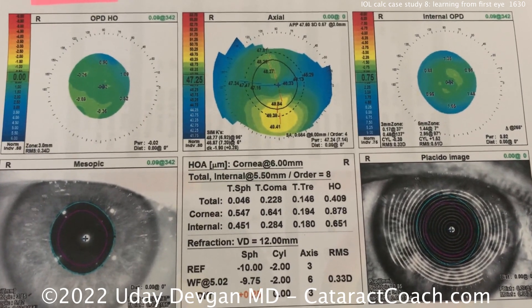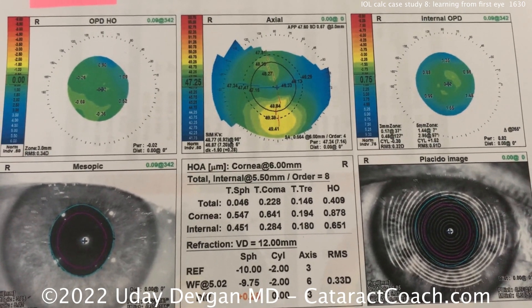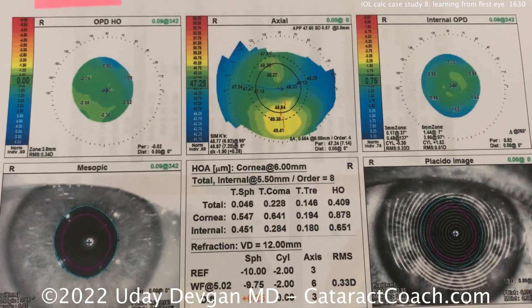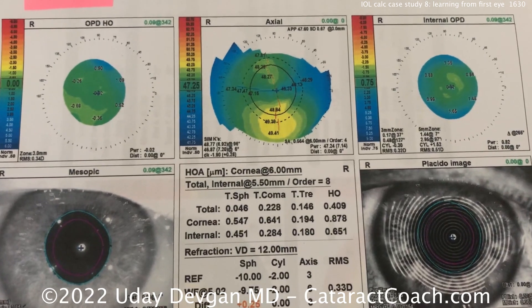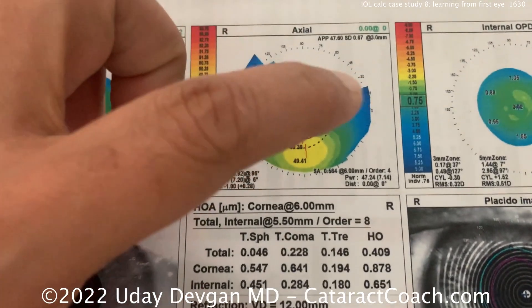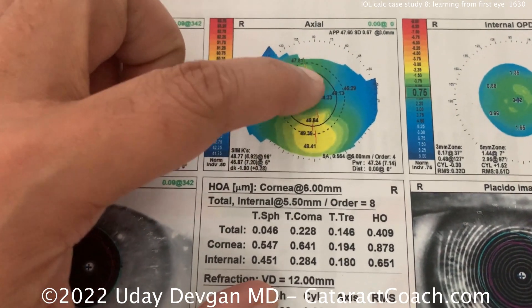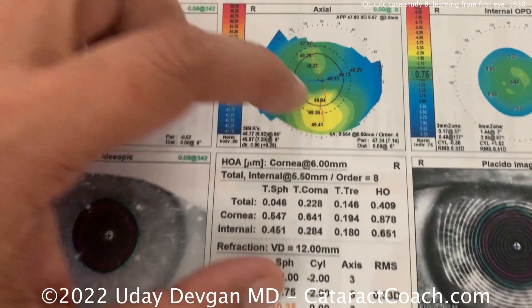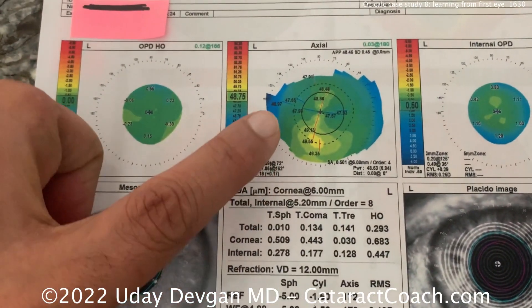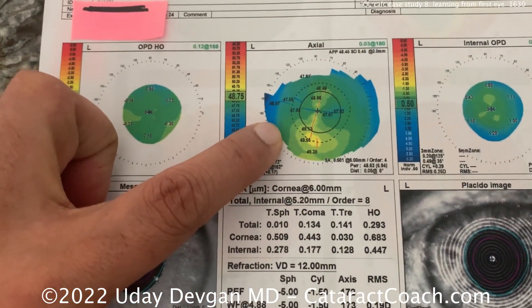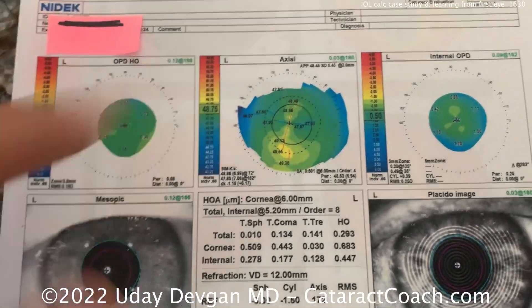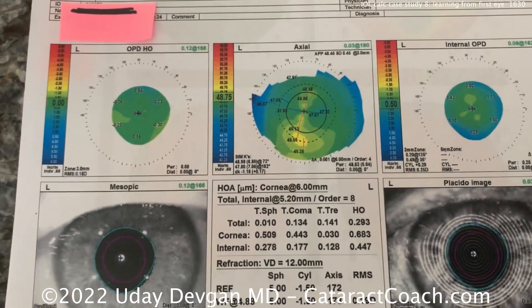Before there were cataracts, the patient could be corrected in glasses to 20/25 vision in both eyes, and that's maybe because it's slightly irregular there in the center. This eye has had the contact in as recently as the day of testing, so this is not going to be quite as accurate.